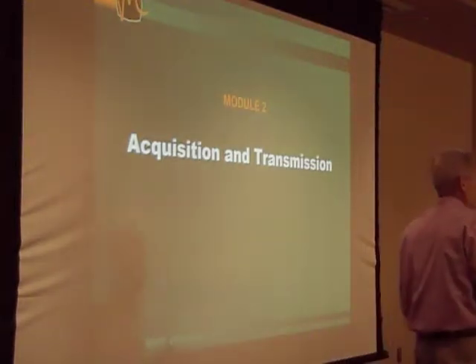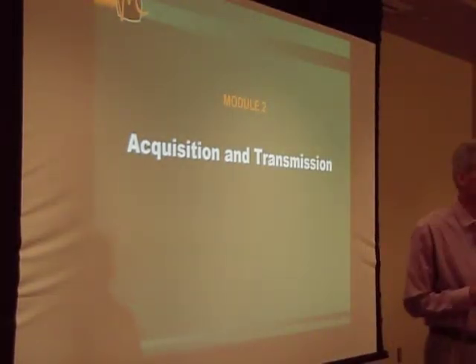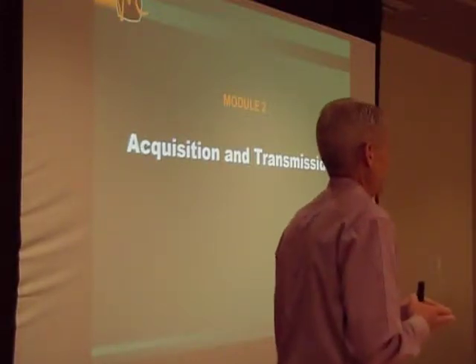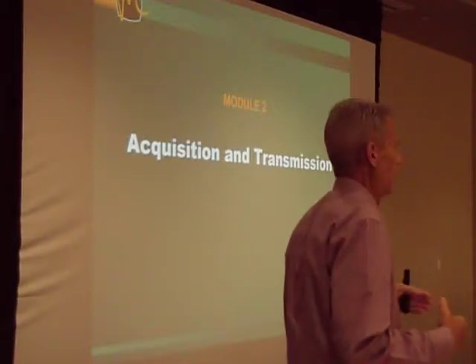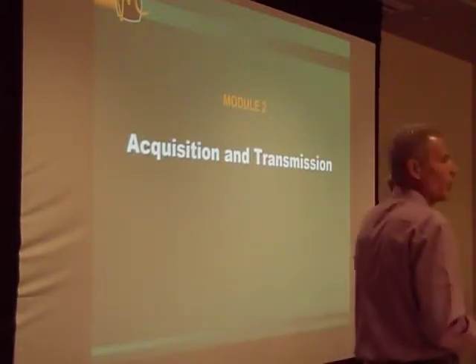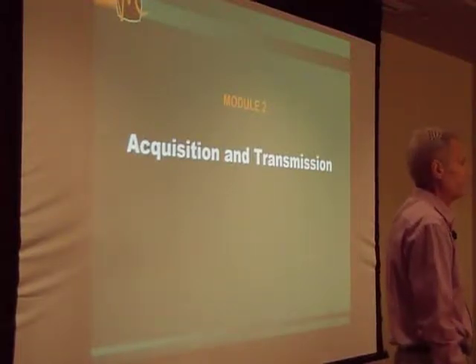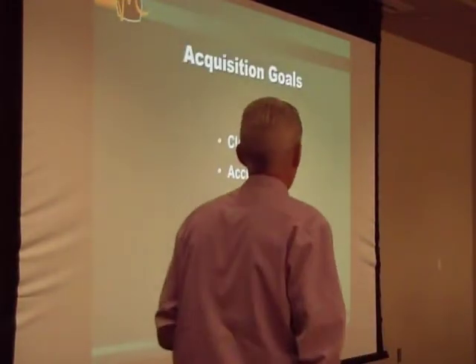This module is somewhat shorter, but there's some very important information when it comes to acquiring a 12 lead. And then, of course, specific to our EMS partners or colleagues, how many of you are actually transmitting EKGs in the field? Excellent. Okay. So we'll talk a bit about that as well.